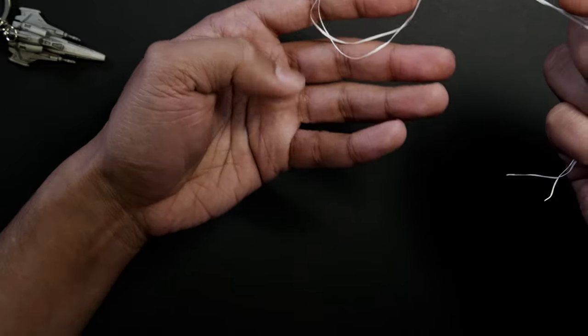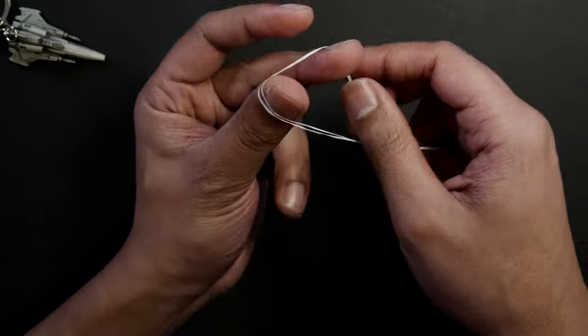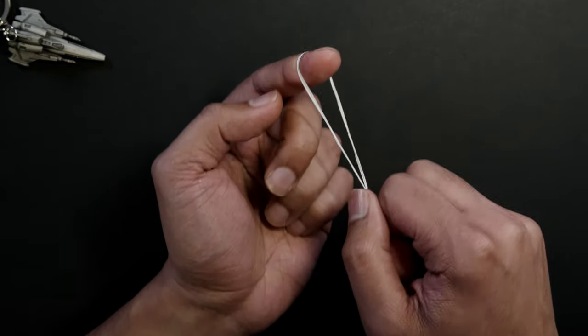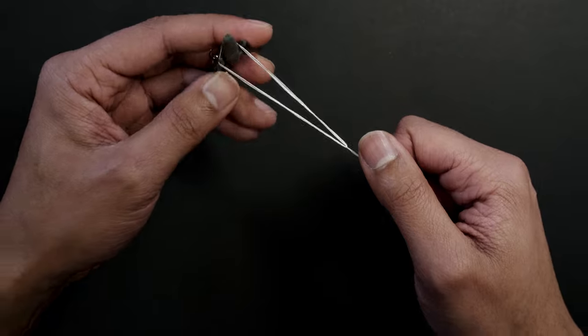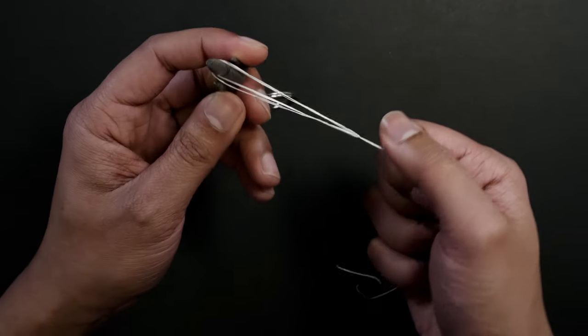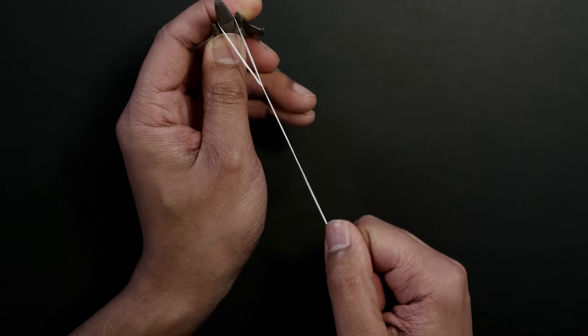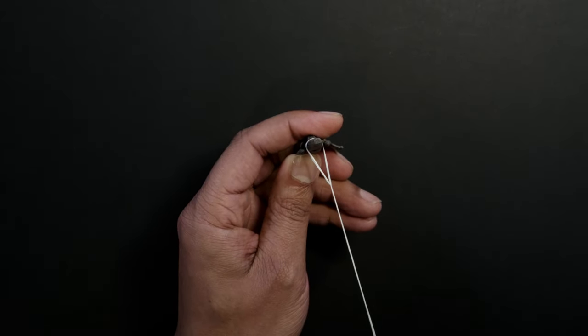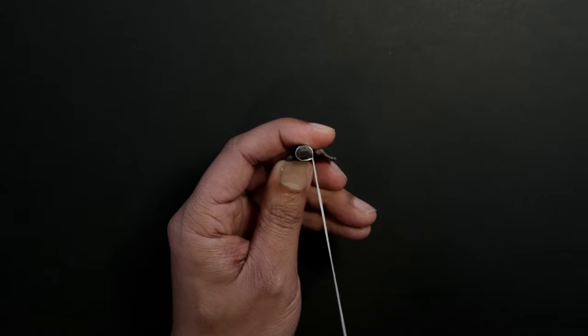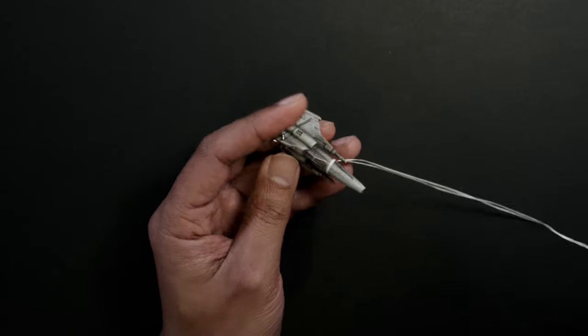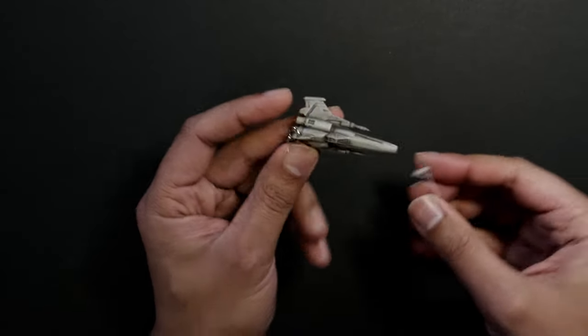And now you've got your ligature with two. So you floss around the teeth. Might use my Viper. Floss around the teeth. And then you pull. And as you pull, you'll notice it gets smaller and smaller and smaller. Back and forth. And it's super tight now. Thanks Viper.